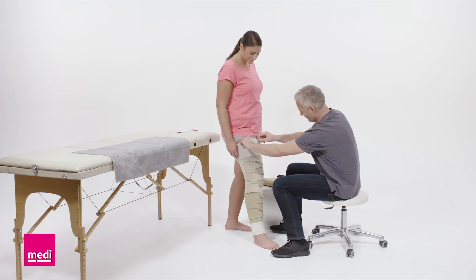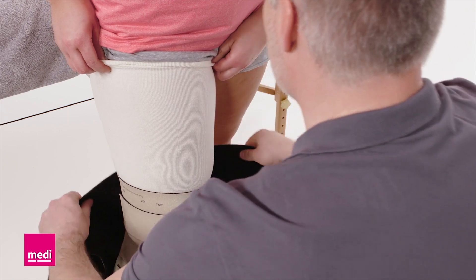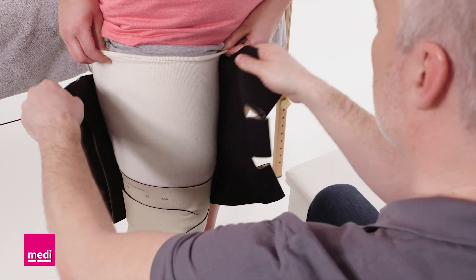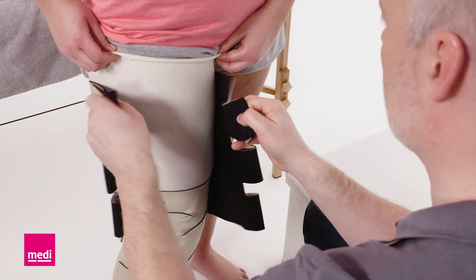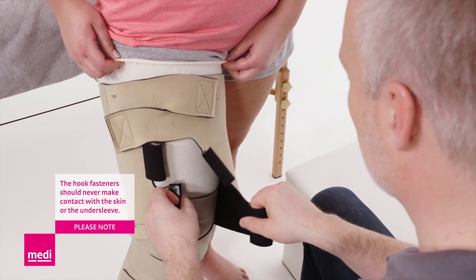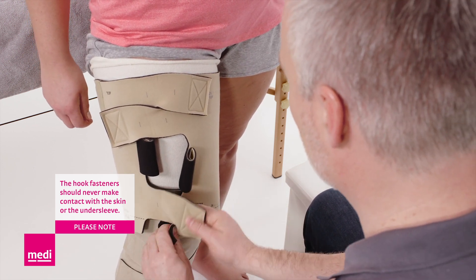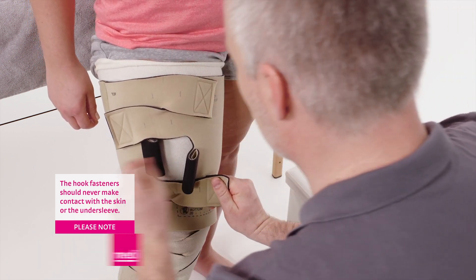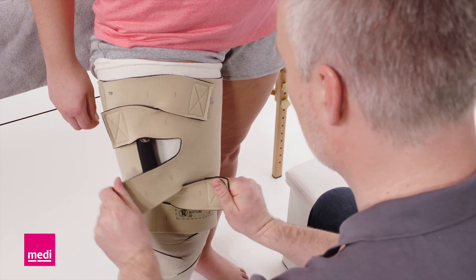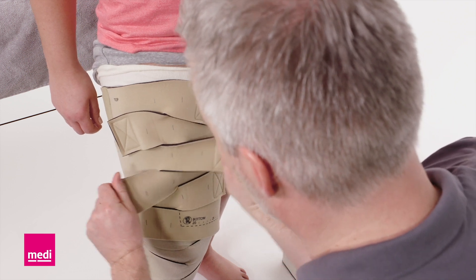Make sure that there are no wrinkles in the under sleeve. Align the garment just below the groin and attach the top two bands loosely to hold the garment in place. The upper leg garment should overlap with the knee component. Attach the bottom most band with firm and comfortable tension.